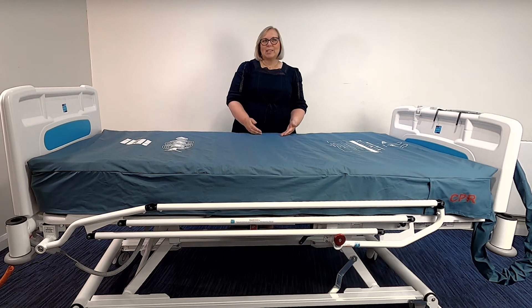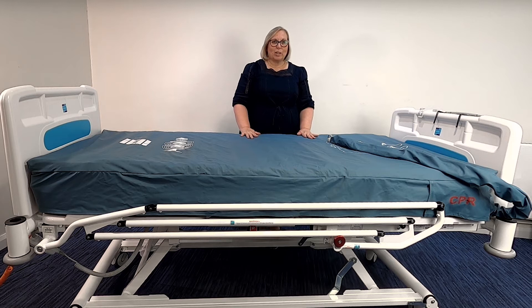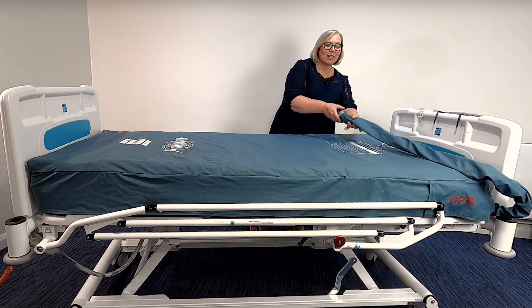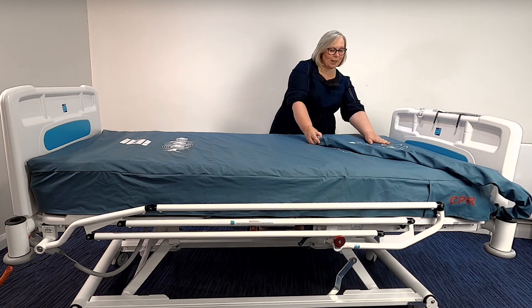Again, a risk assessment should be carried out to ensure product compatibility. Please refer to your local policy and guidance on equipment selection and to the full use and manual instructions prior to using the mattress in relation to safe use. When setting up the mattress, firstly place the mattress onto your bed frame, ensuring that the umbilical cord is at the foot end of the bed and the feet symbol is facing upwards.